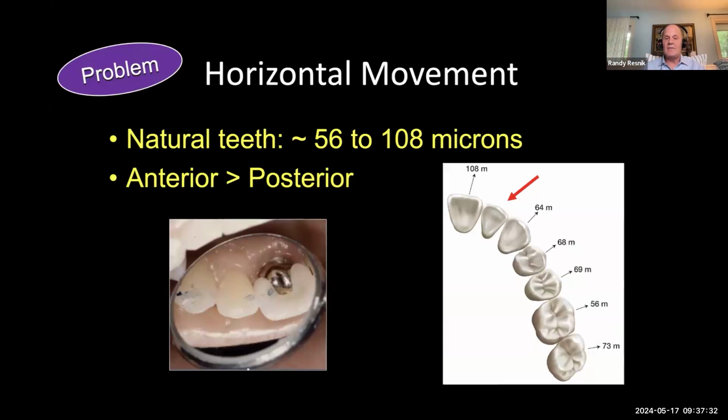So if you look at the contact on that lateral implant, you have to be very, very careful that you don't overload this. So when you have that patient clench, you really have them clench as hard as they can. You also check the anterior guidance. So you make sure that when they come into protrusive, they don't have a long contact on that implant crown. Because if you're only checking the occlusion with light contact, then that implant can be in hyperocclusion, mainly because of the movement of the other anterior teeth.